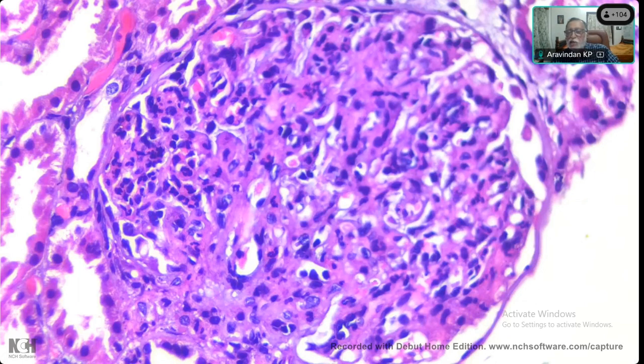In my student days, when I was an MBBS student, one would never see renal biopsies in such cases, as this used to be very common among children. Acute nephritis, post-streptococcal glomerulonephritis producing this picture was very common in children because it used to follow throat infection, and frequently in our place infected scabies was followed by this kind of picture.